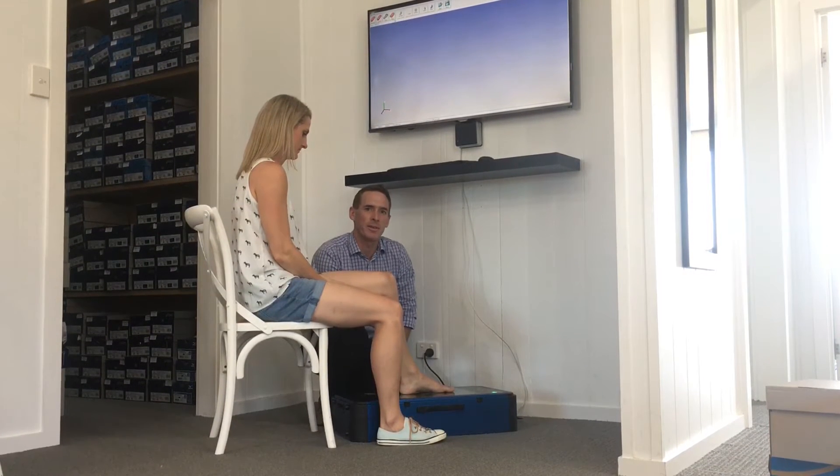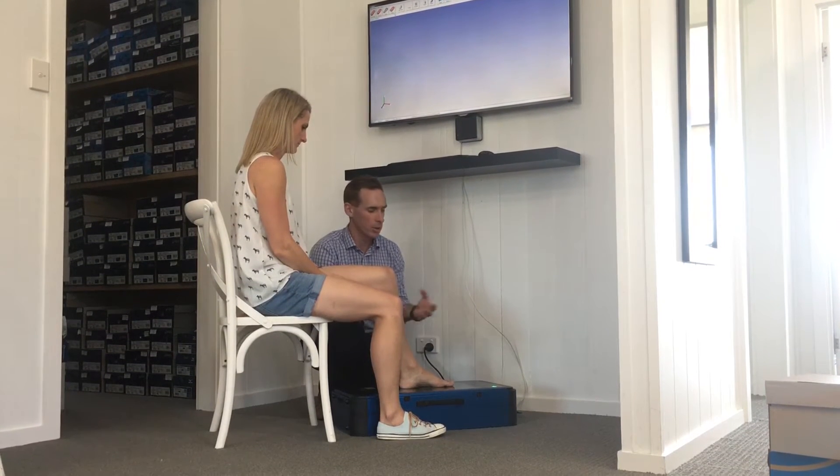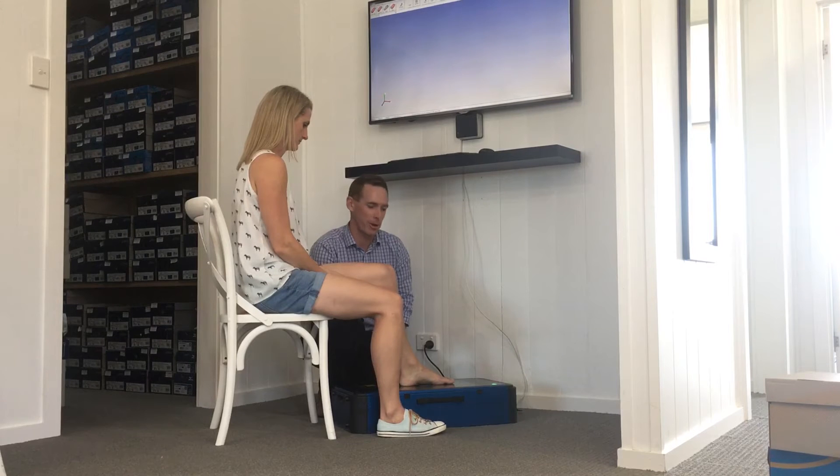Hi, my name's Peter. I'm a sports podiatrist from Shoes, Feet, Gear. Today we're scanning a foot using a 3D laser scanner. We can have the foot with full weight through it, standing up on top of the machine, or no weight at all. Today we're just doing a semi-weight bearing scan.